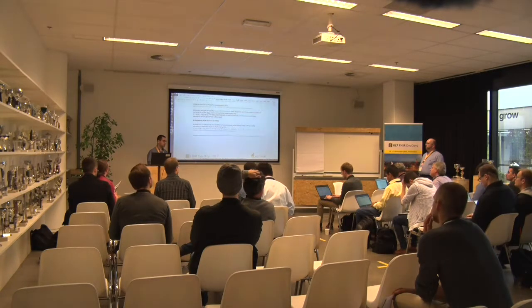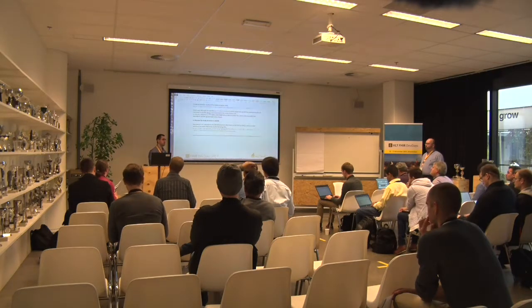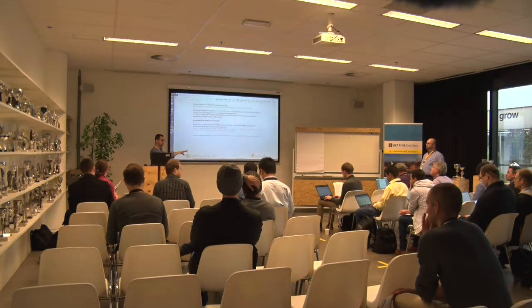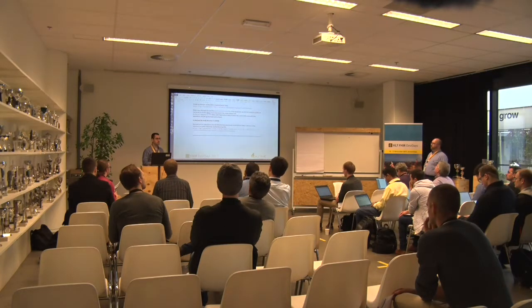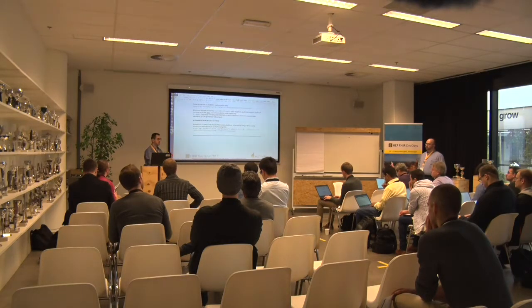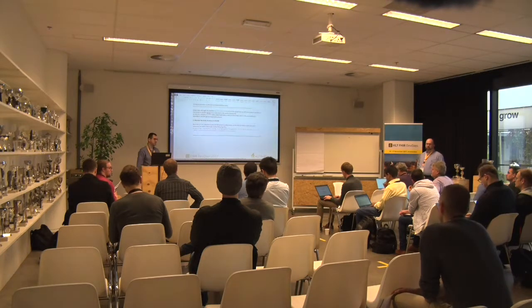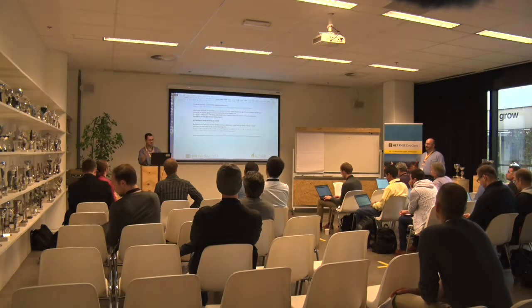The URL would change. What you could do, if you have the link from the FHIR, is just update the FHIR information with a put request to the FHIR server. You can update that one thing. You have to do it for each study. In theory, yes, but the reality is, if you did your homework, what you probably would do as a customer is make the host name part of your URL to the VNA a virtual IP, so you could point it to the new one versus the old one. That's the easiest way to do it. There are tricks for that; that's more on the IT side.